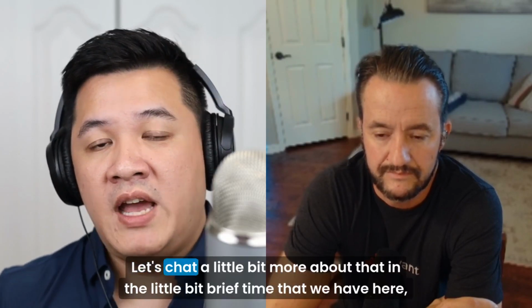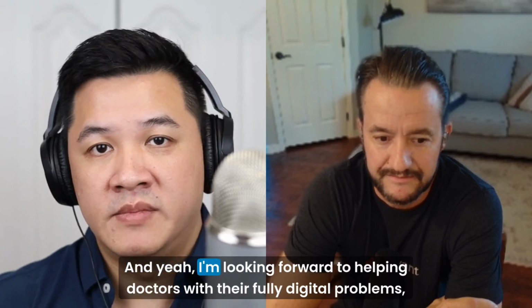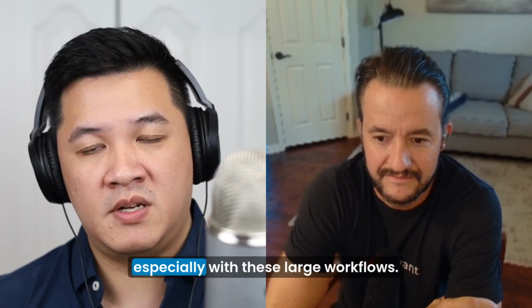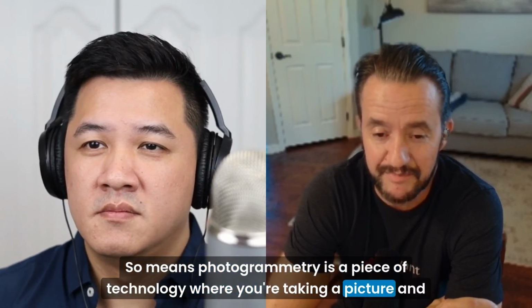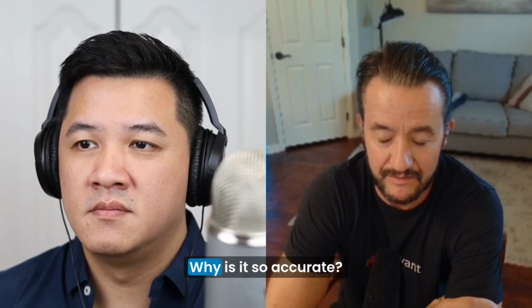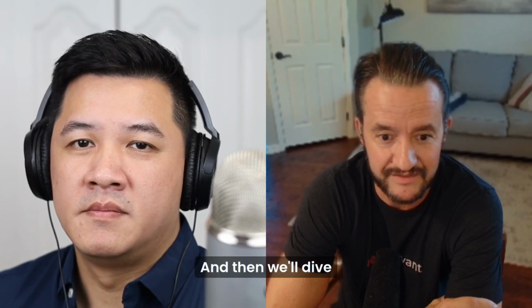So let's chat a little bit more about that in the brief time that we have here, Rob. I'm looking forward to helping doctors with their fully digital problems, especially with these large workflows. Photogrammetry is a piece of technology where you're taking a picture and capturing implant coordinates in 3D space. Maybe just talk about that. Why is it so accurate? What is photogrammetry? And then we'll dive in.